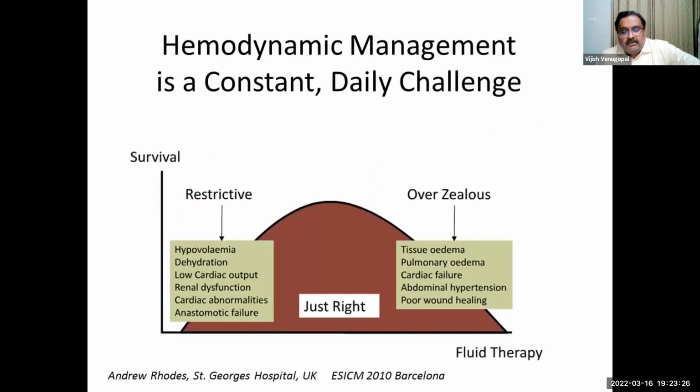Another very important thing that you can detect from the arterial line is the probability of preload responsiveness, finding that out. So hemodynamic management is a constant daily challenge.